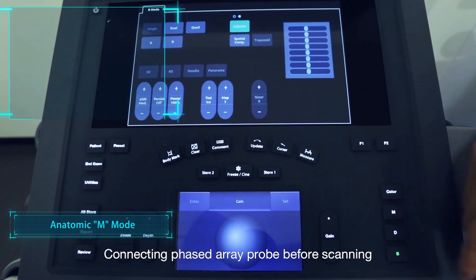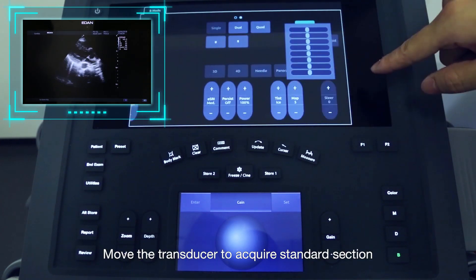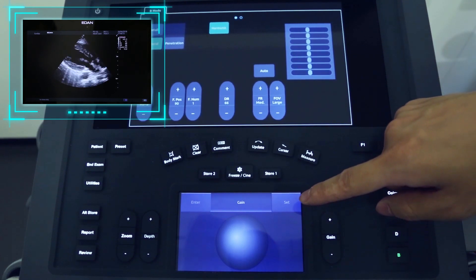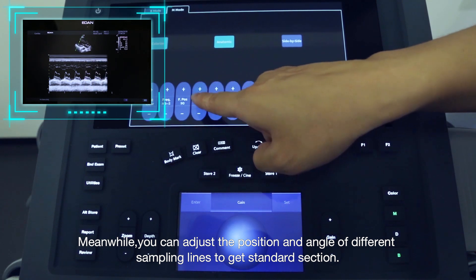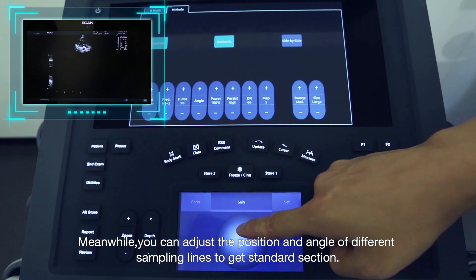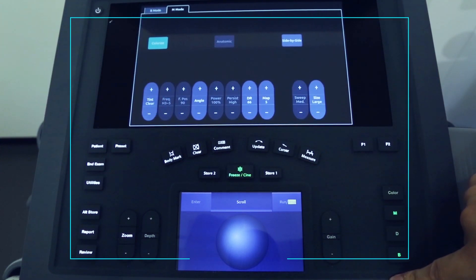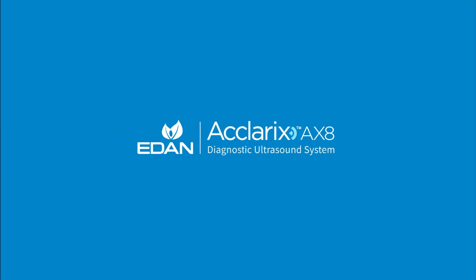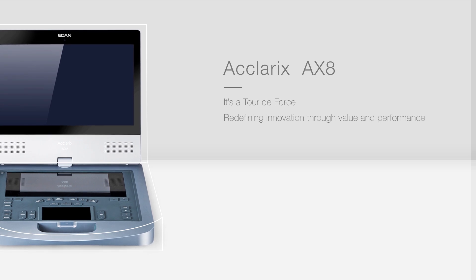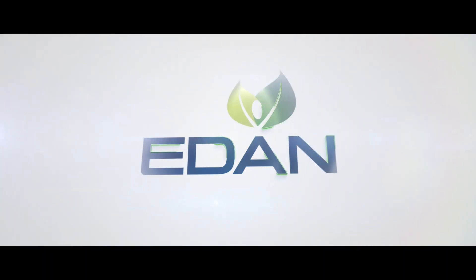Connect the phased array probe before scanning. Click the Preset button and choose the proper presetting. Move the transducer to acquire the standard section. Click the M mode button, then click the Anatomic key on the touchscreen to activate. You can adjust the position and angle of different sampling lines to get the standard section.